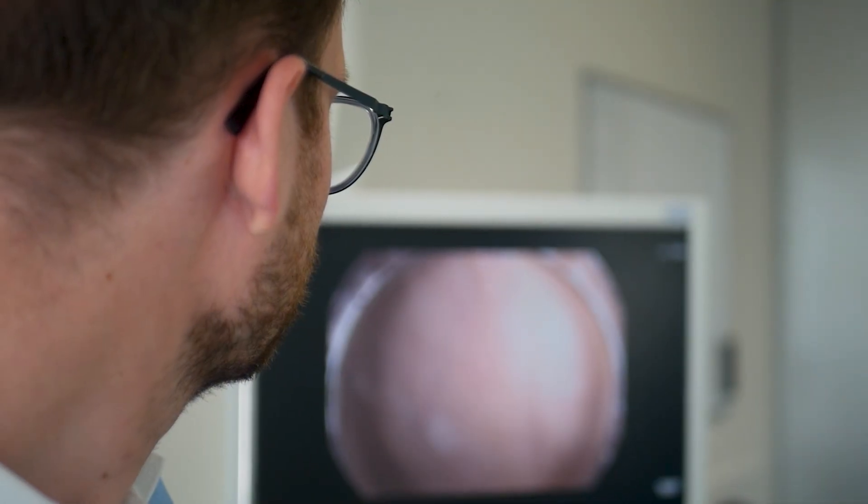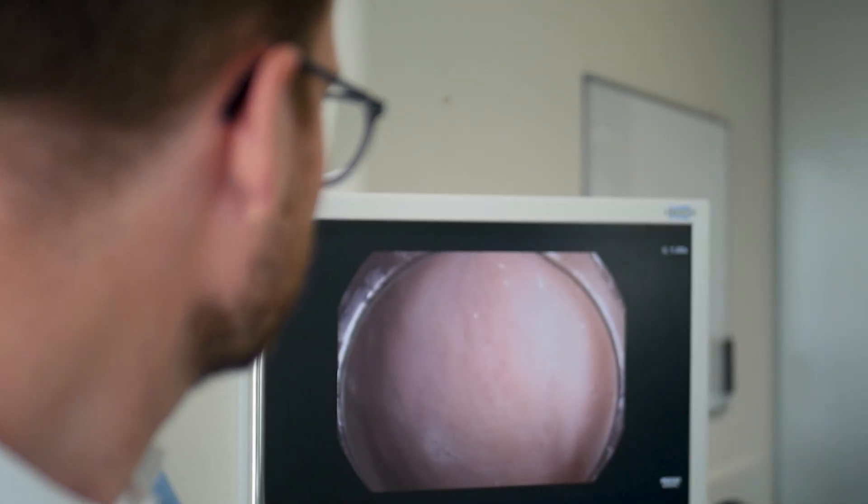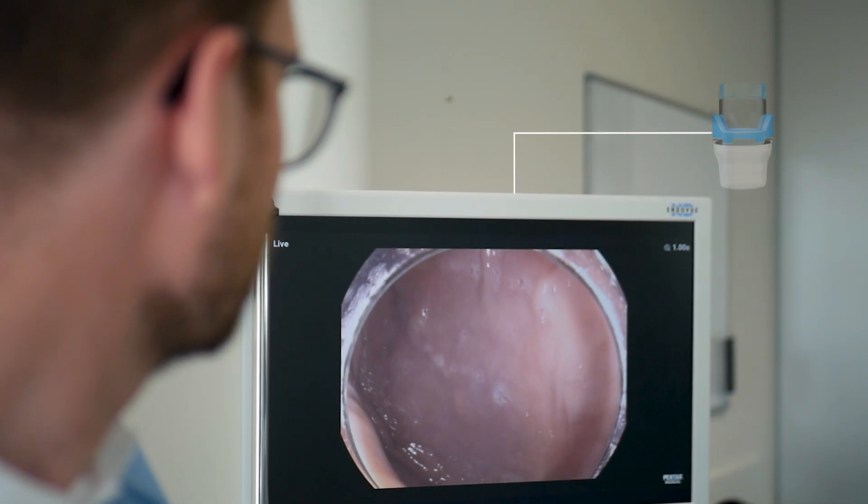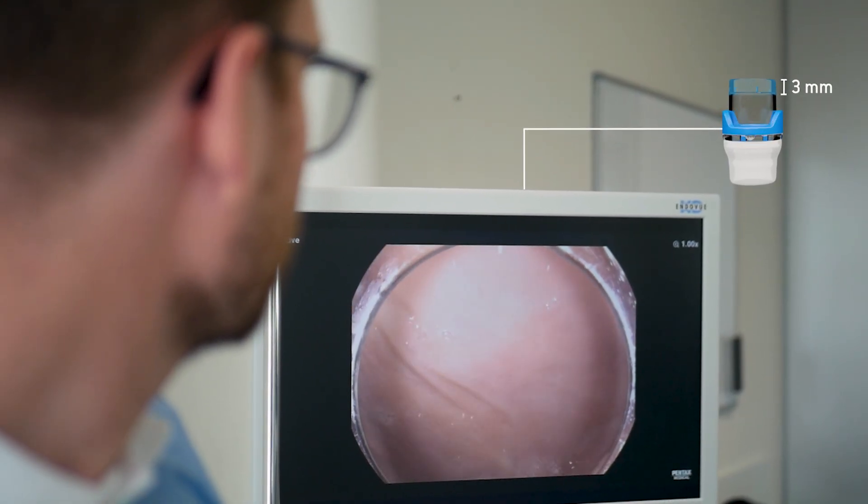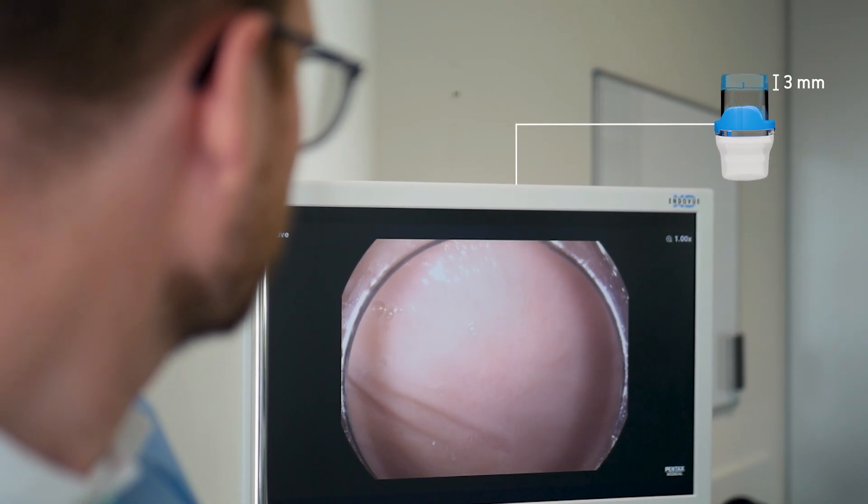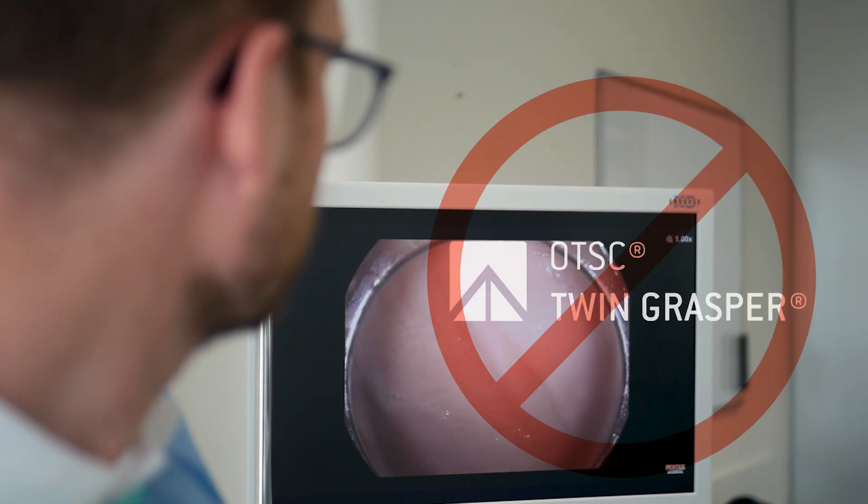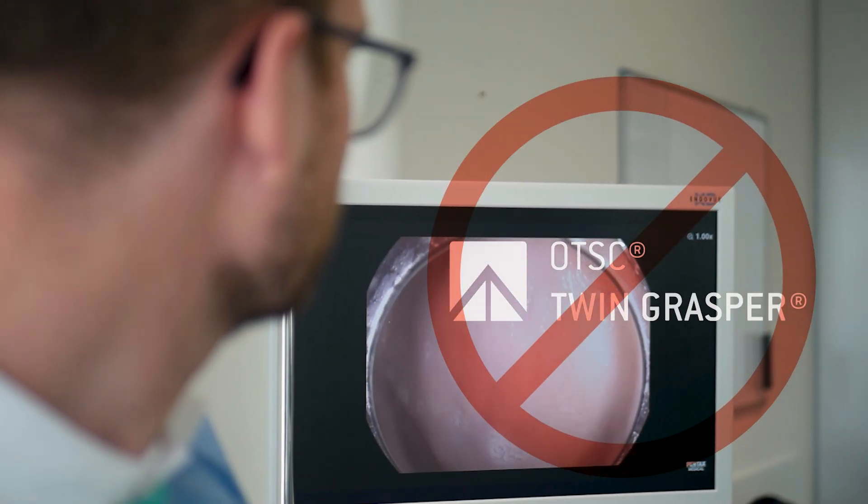Therefore, for cases where even better visualization and easier navigation in narrow lumens as well as further limitation of the tissue amount are desired, a variant with a cap depth of 3 mm is also available. However, this variant is not compatible with the OTSC Twin Grasper.